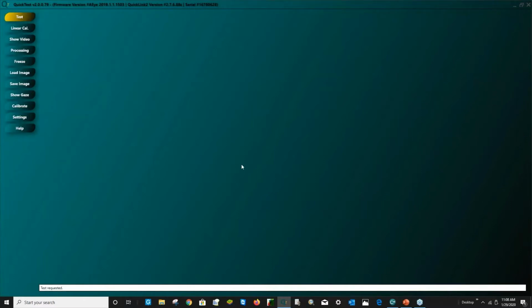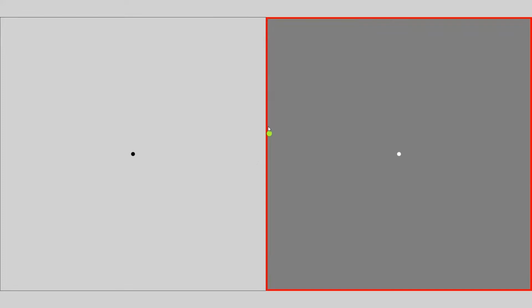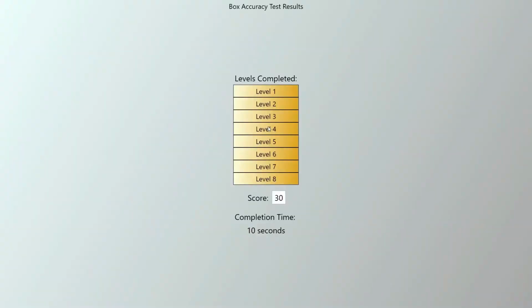We'll go ahead and accept that, and I'll show you one of a battery of tests that we use to not only compare our camera firmware from one to the next, but also to compare against our competitors, so you can have best-in-class accuracy and performance. So you can see my live gaze is the green dot. I'm looking at the white dot, and it continues to get smaller and smaller after I look, and I'm able to look at the target.